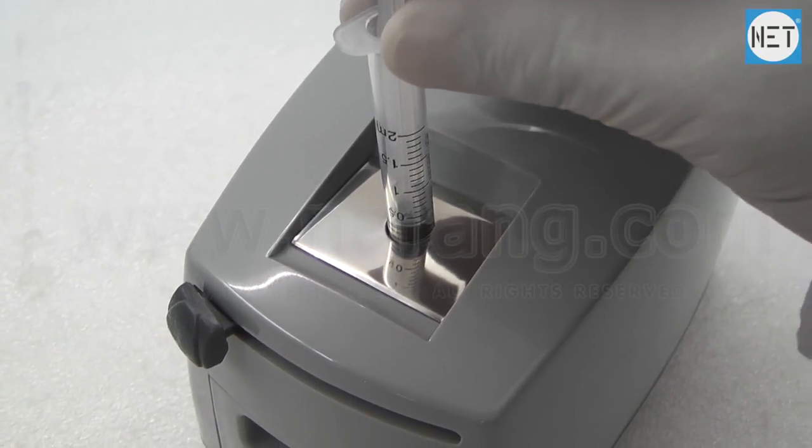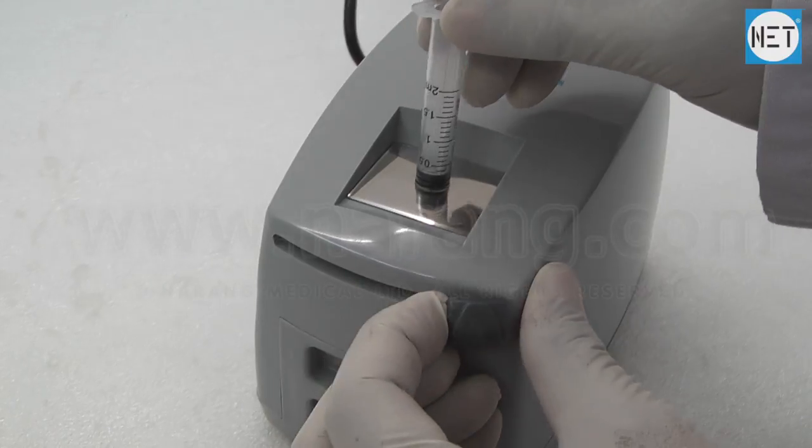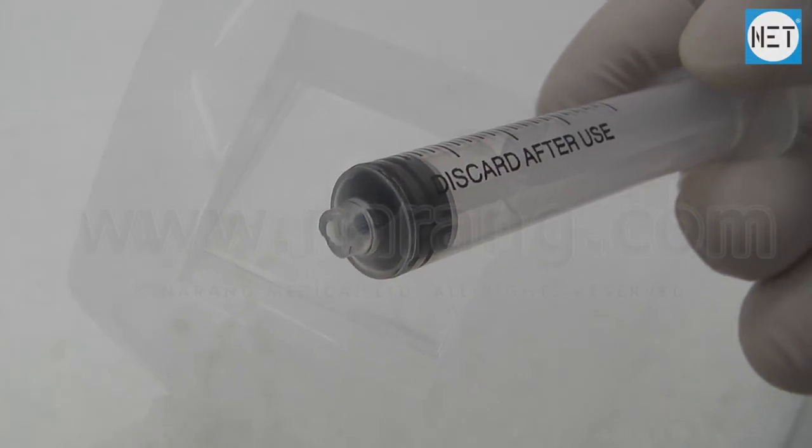To cut the syringe hub, pull the handle of the syringe cutter from left to right. Now the syringe can be disposed of. The manual provided should be read carefully before use.